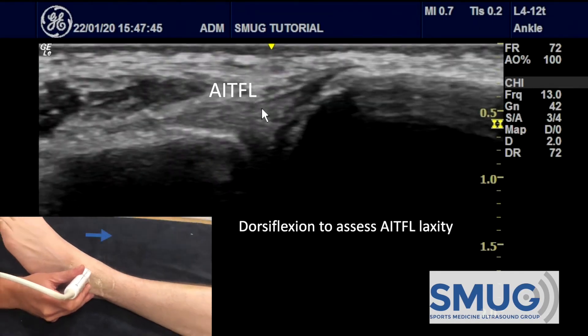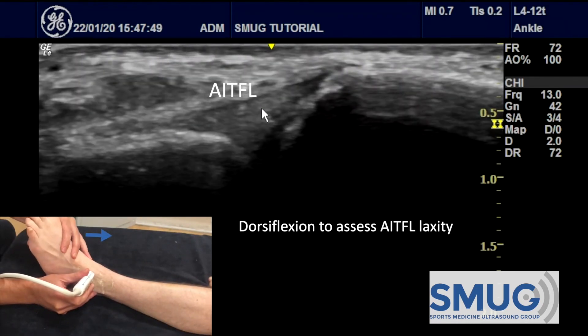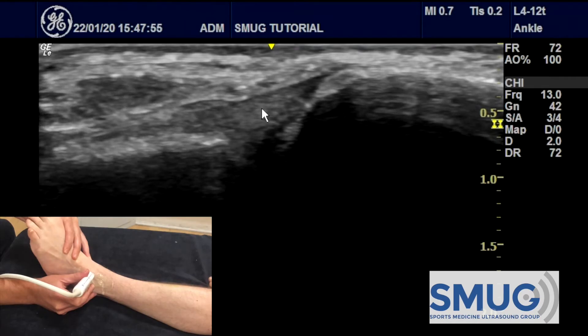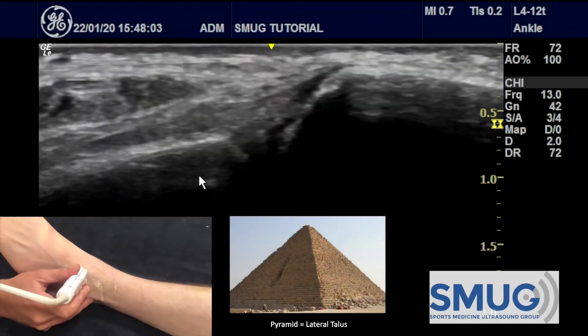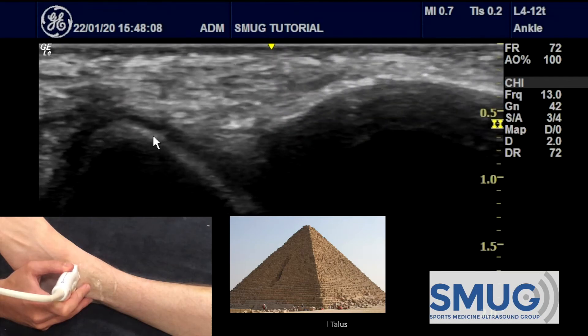To assess the laxity of the AITFL we use dorsiflexion. If I gently and passively move the foot into dorsiflexion, despite the movement you can see that the tibia and fibula do not open up at all — so that ligament is doing its job.